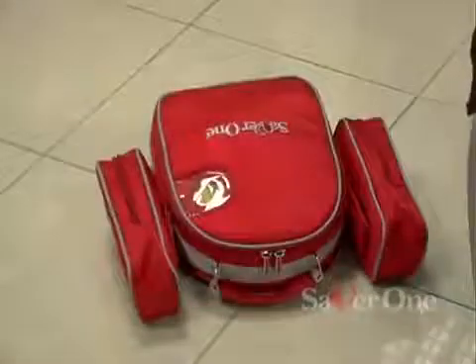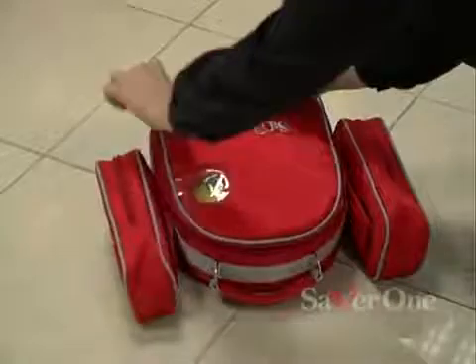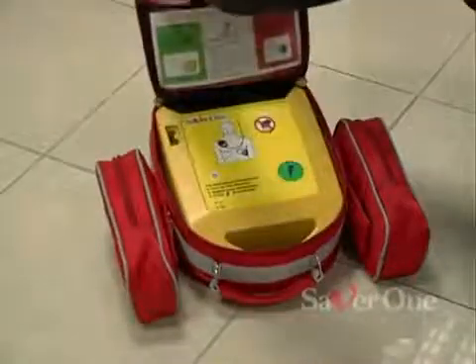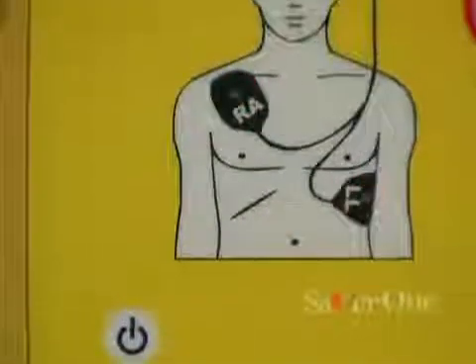The Saver One allows to restore a cardiac rhythm through defibrillation, which is a duly energized direct current passing through the heart. Thus, a spontaneous cardiac rhythm may appear.